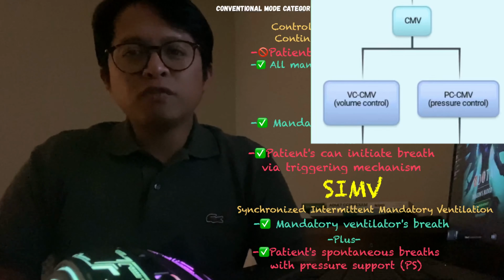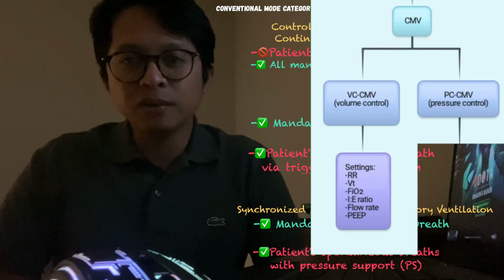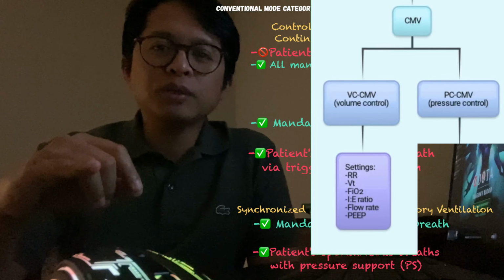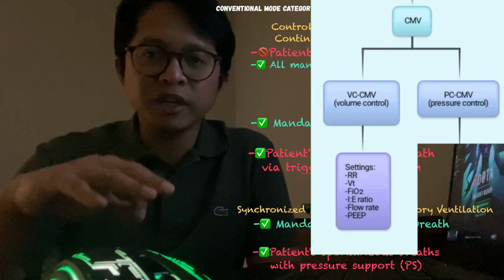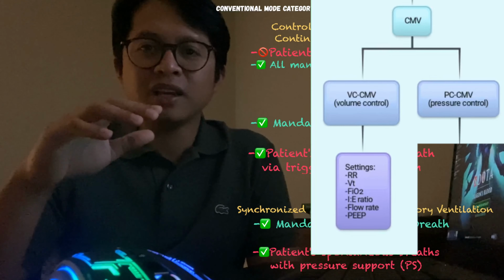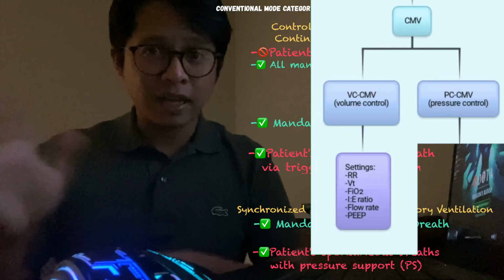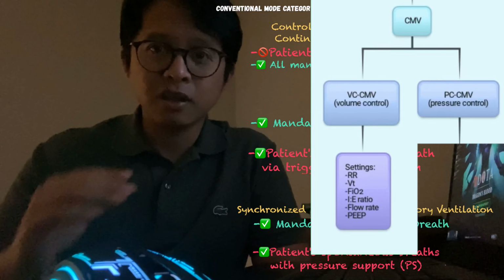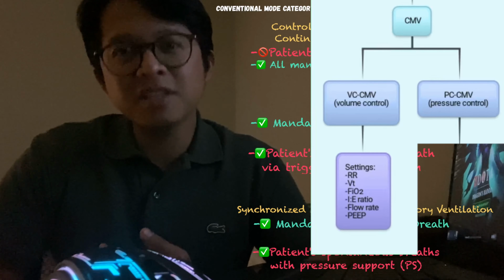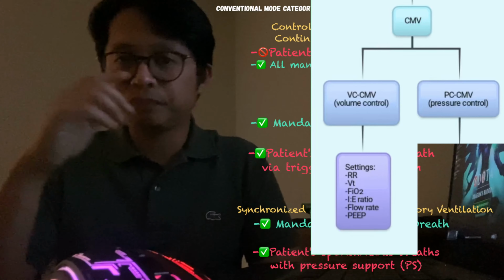The possible settings for volume-controlled ventilation mode are FiO2, RR, VT, IE ratio, flow rate, and PEEP. Therefore, this mode is volume-controlled, time-cycled, machine-triggered, and constant inspiratory flow. The patient receives the set tidal volume with every mandatory breath, and the patient can do nothing. Okay? Patient can do nothing. The number of mandatory breaths is defined by the frequency or the RR. This means that the minute volume remains constant over time.